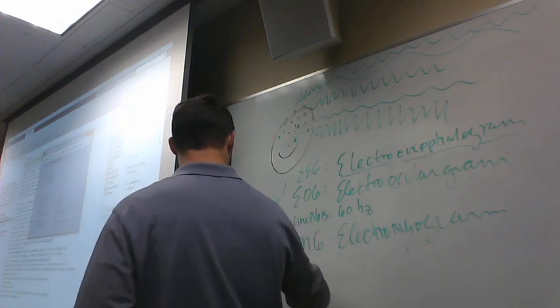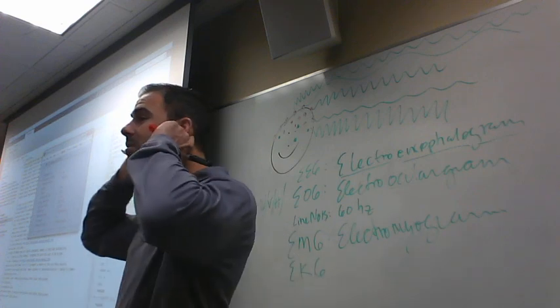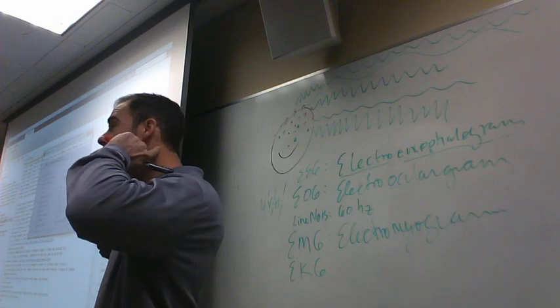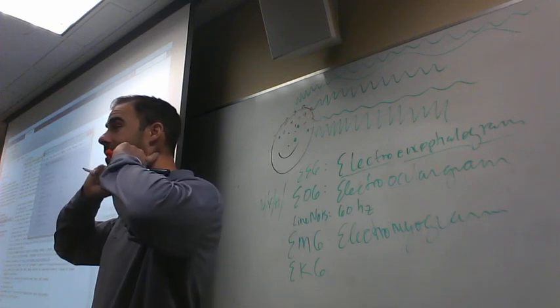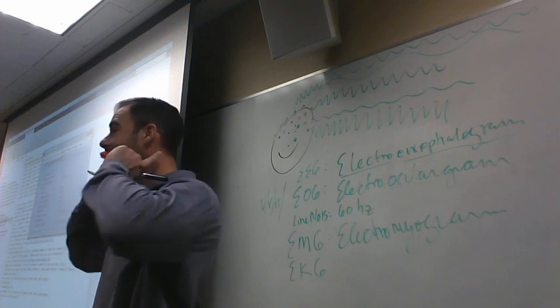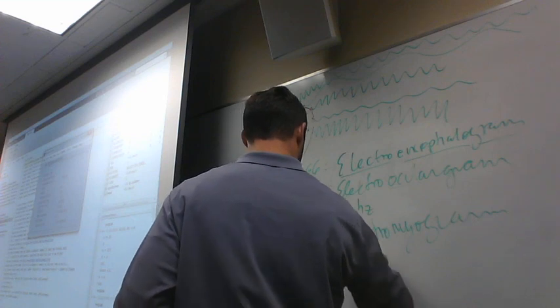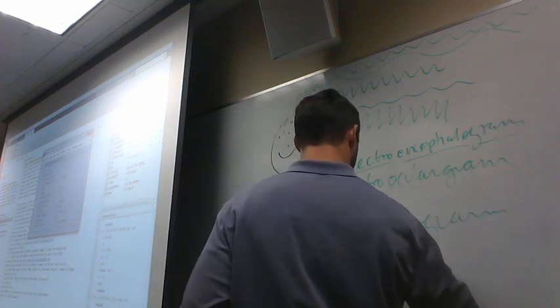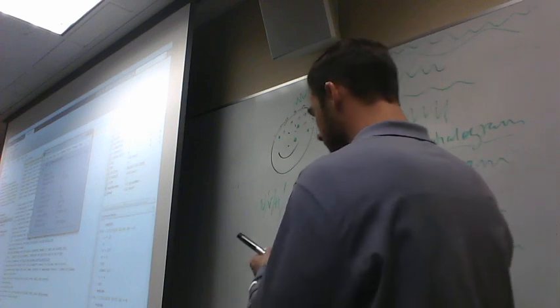Sometimes you can see EKG too, particularly if you put the mastoids on the wrong spot and it goes a little bit closer to your carotid arteries, you'll catch that heartbeat pretty good. So we could definitely catch EKG, which is basically electrocardiogram. Electromyogram, though, is muscle activity.